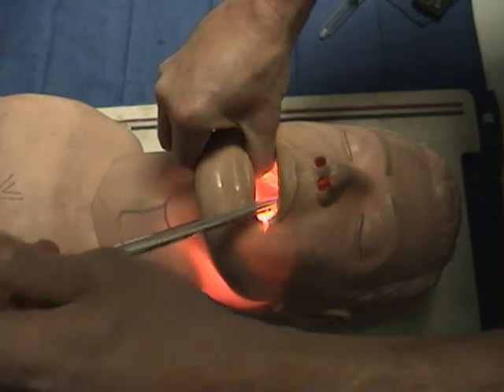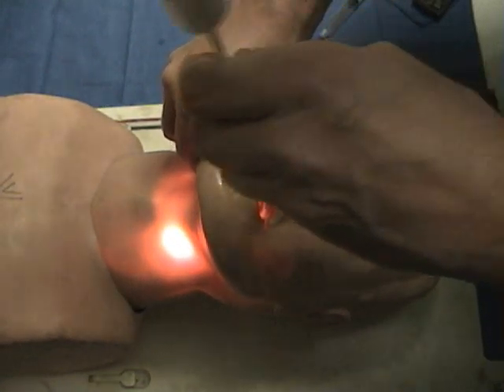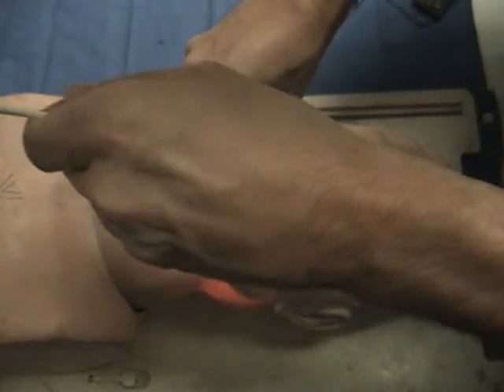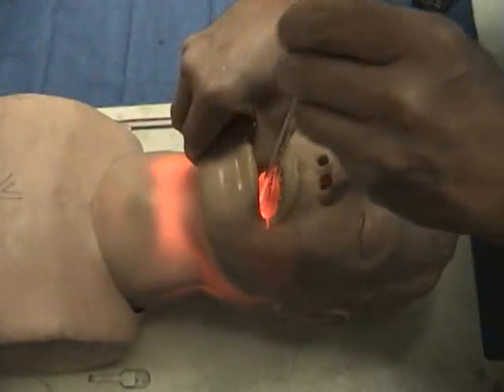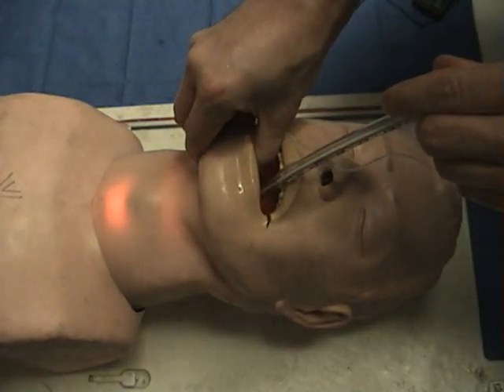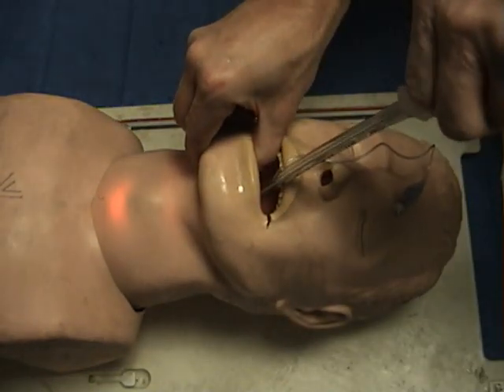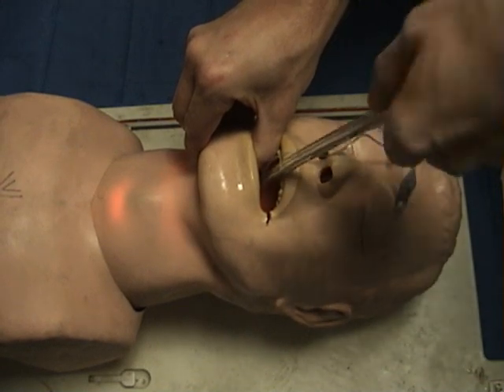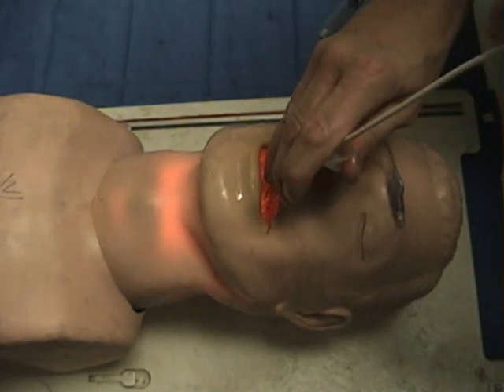We show the left side of the neck transilluminating, and then the right side. Then we place the stylet midline and try from the midline with a scooping motion until we see the light go through the laryngeal inlet into the lower trachea — the suprasternal notch area is transilluminated. Notice that there is always light continuity from the top to the bottom, to the suprasternal notch. Once in that position, we advance the tracheal tube and then pull out the stylet.